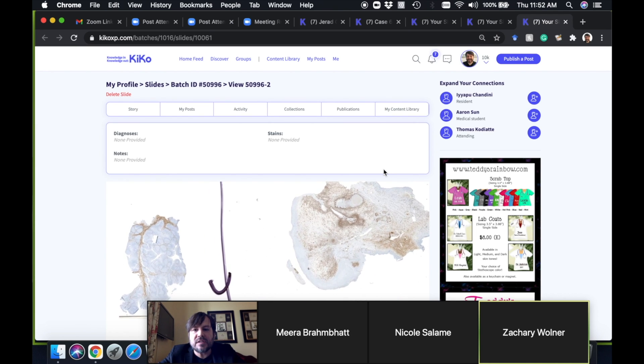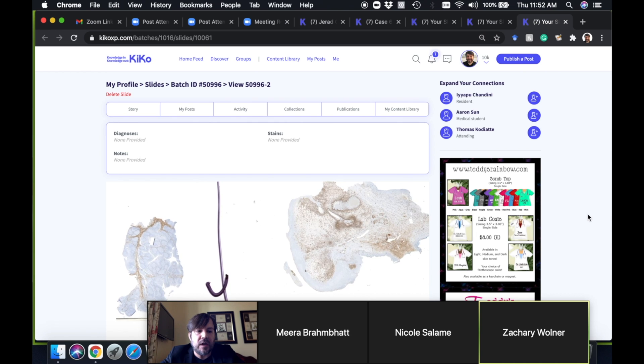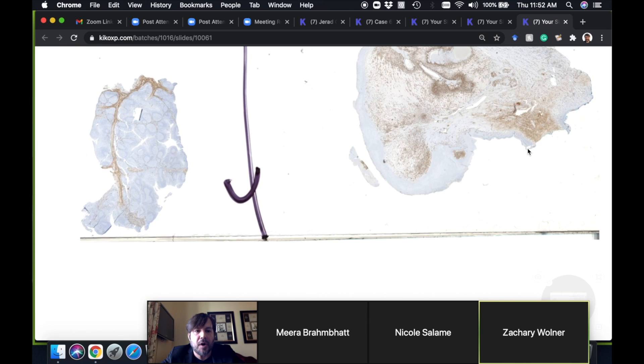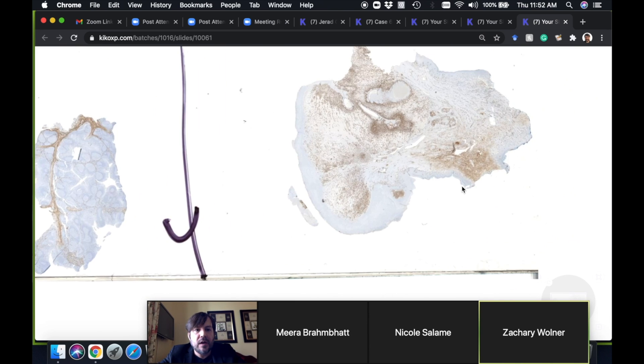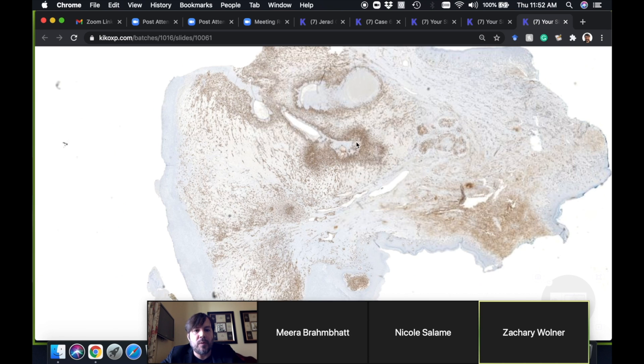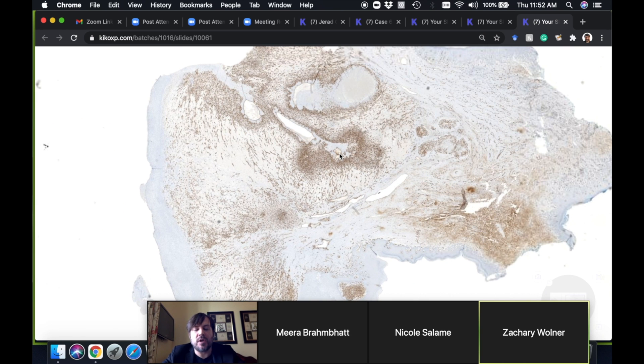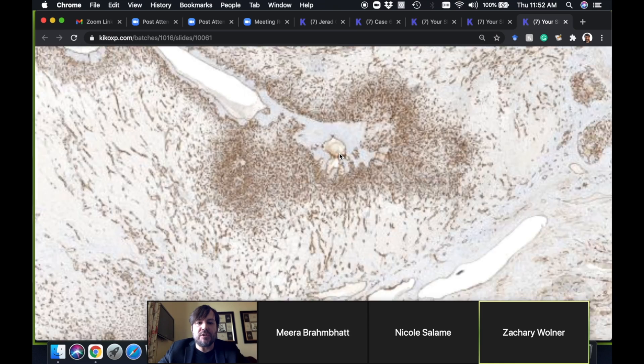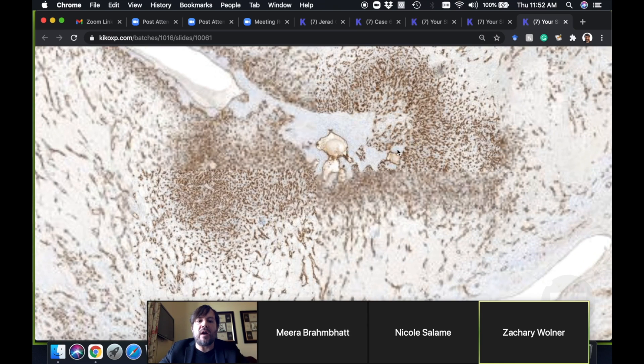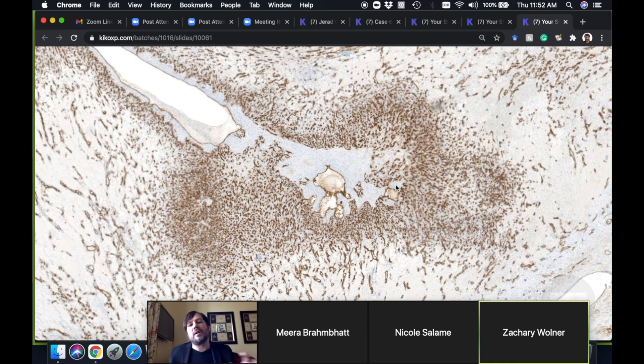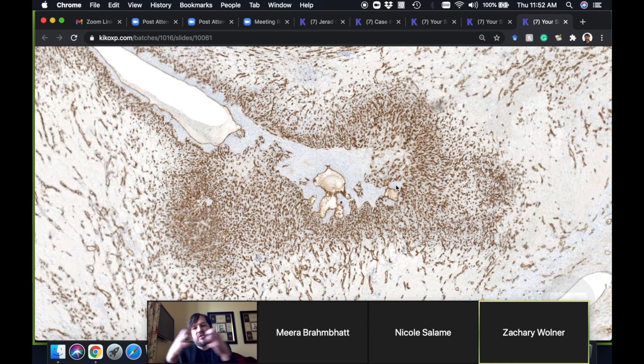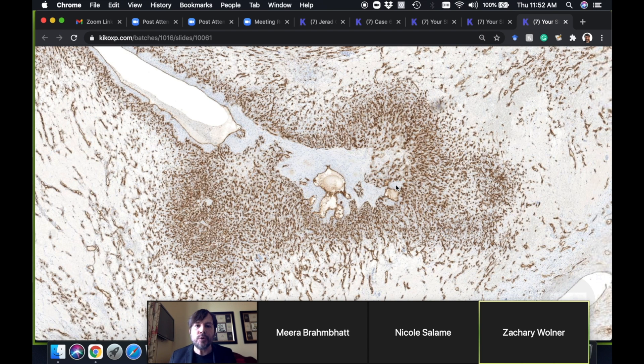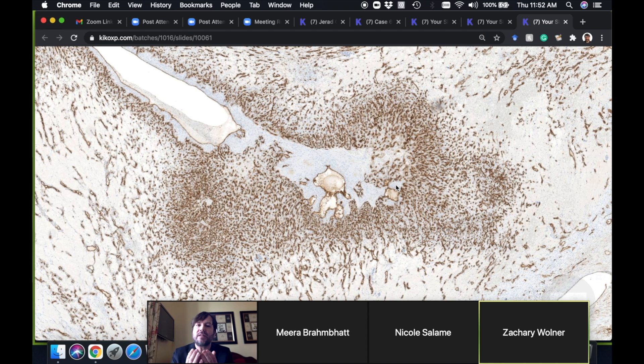This is an example of CD31, which is an endothelial marker. What it can help with is in cases where you have a very busy or very cellular vascular lesion. Sometimes the vessels get so packed closely together in some vascular lesions that it's hard to see the lumens, so it can look more like a solid sheet of cells.